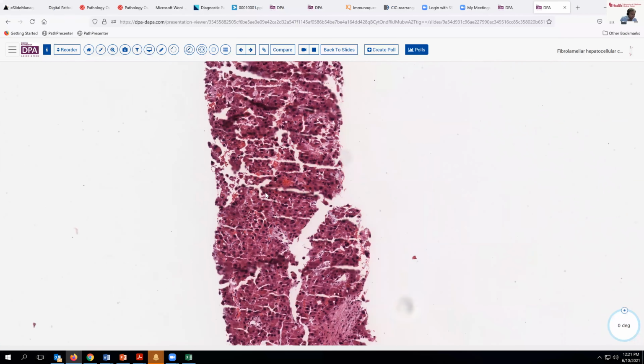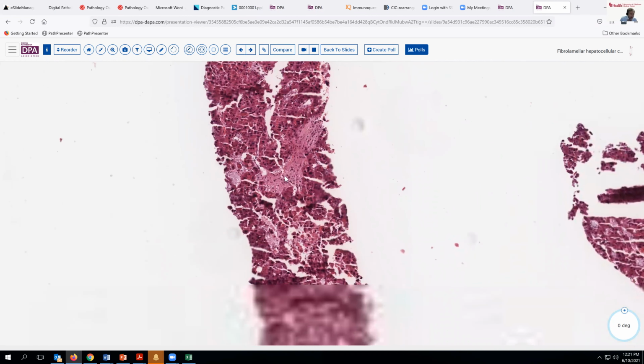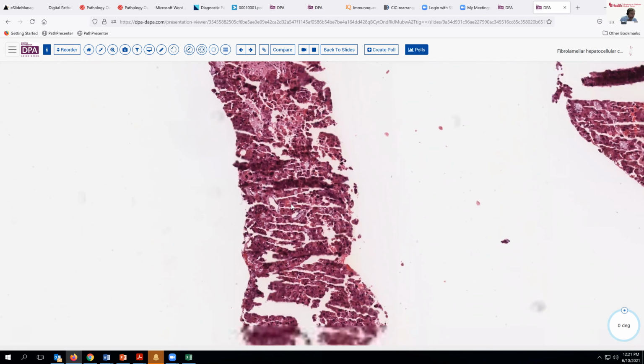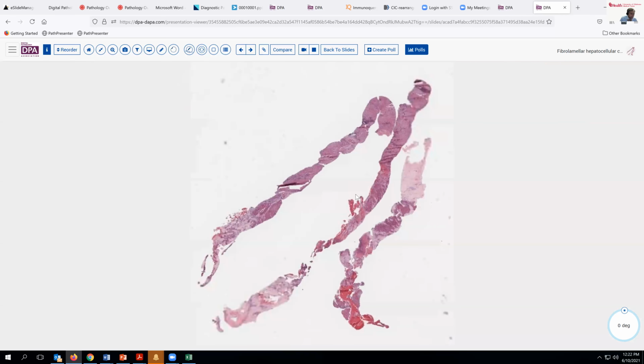So as you look at this, that should cross your mind, especially if this is a younger patient that fits into those age group categories. Finding necrosis, of course, is possible as well. Most of the time you're going to have to make this diagnosis on the needle biopsies, and that's why I've tried to include these, because once you get a resection specimen, it's much easier.